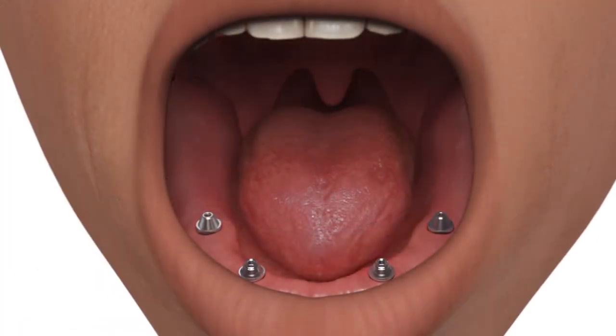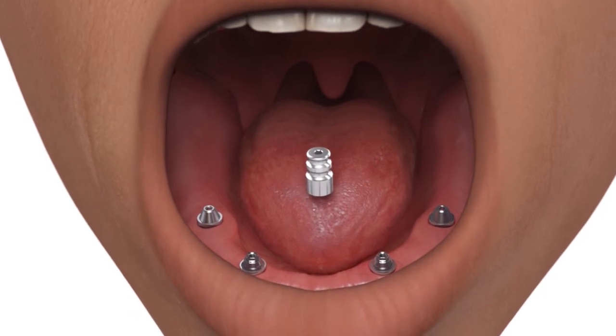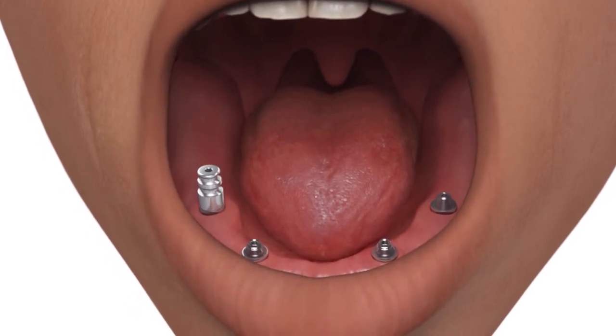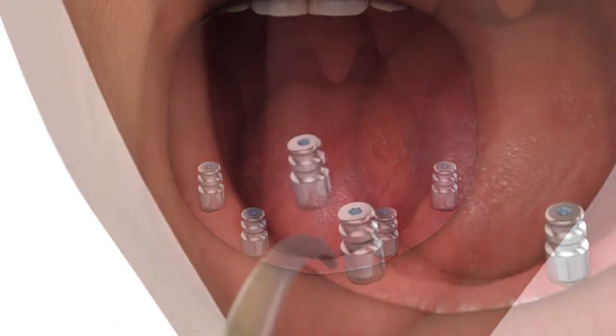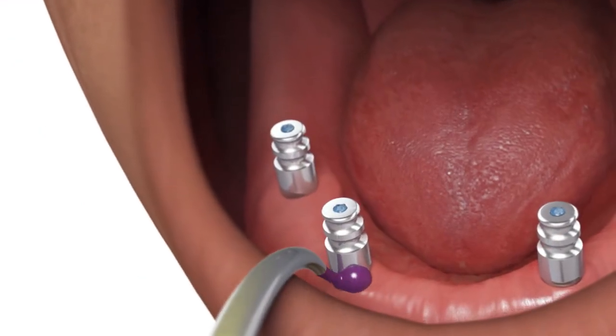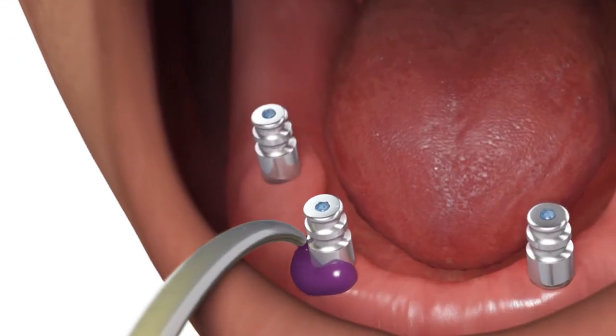Place the multi-unit indirect transfer copings onto the multi-unit abutments and hand tighten. Block out the hex holes using a material of choice. Syringe medium or heavy body material around the indirect copings.